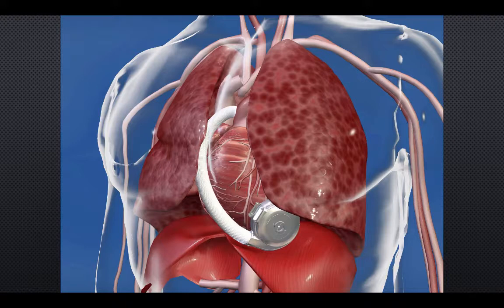The pump speed varies by device, but is usually between 2,000 and 10,000 RPMs. The power is between 4 to 6 watts and the flow is between 4 to 6 liters per minute. The pulsatility index measures how much pulsatile flow is provided by the patient's heart. It is between 1 and 10, and the higher the number, the less the LVAD is supporting them. Always contact the patient's LVAD coordinator and have those numbers handy when you do.